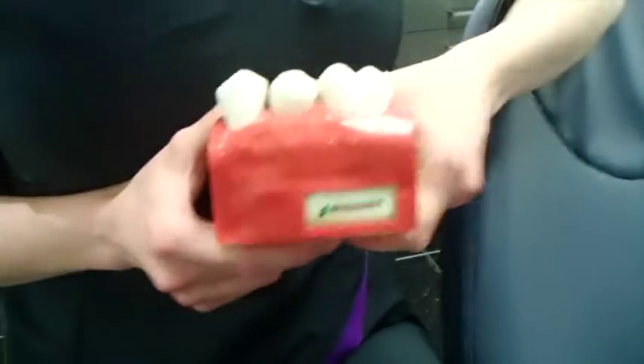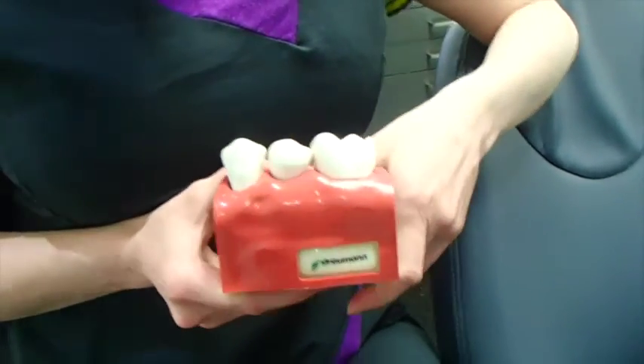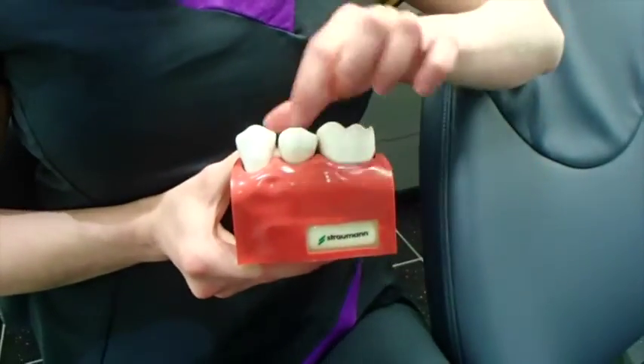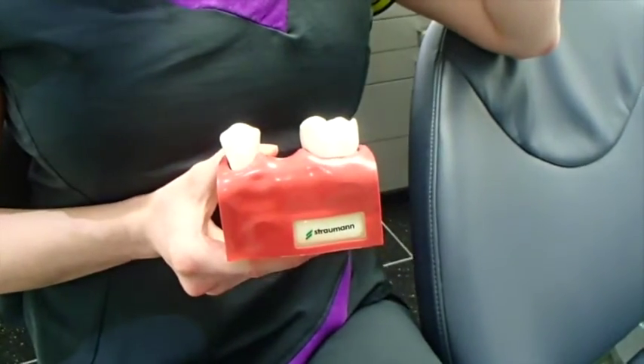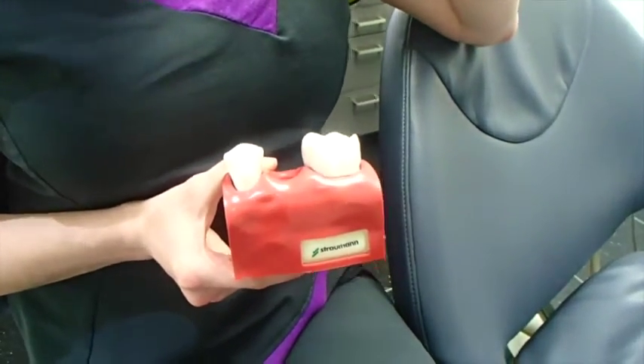Hi, I'm MJ and welcome to your implant demonstration. Here's my little tooth model, and when you lose a tooth it gets extracted and you're left with a space and you've got a number of decisions to make.